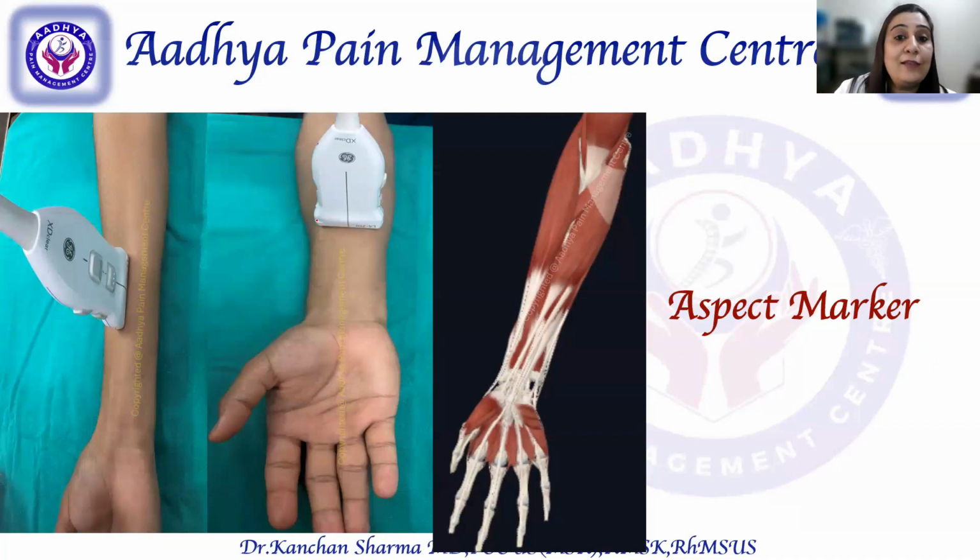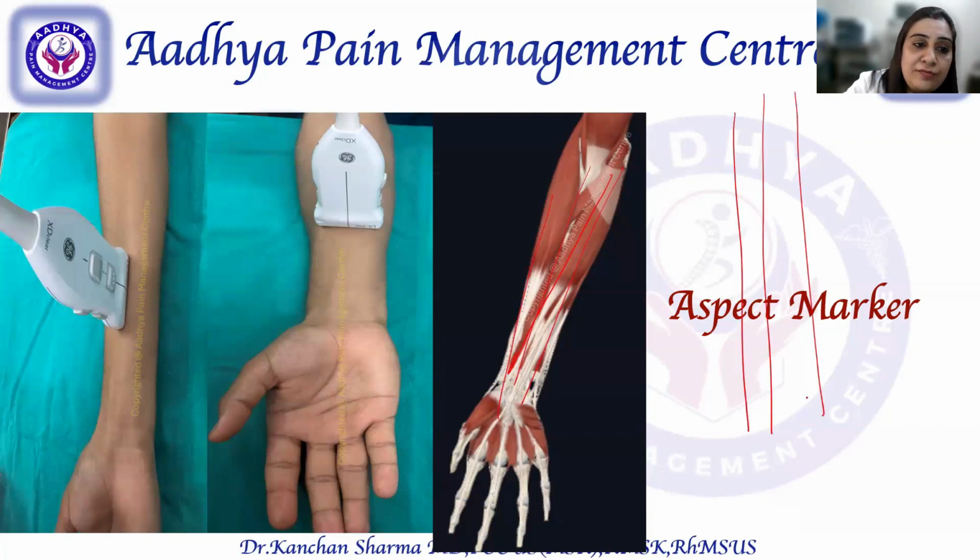So if I have to scan the forearm muscles, how are my forearm muscles? Like this, straight, like that they are going. Now if this is my aspect marker, if I have to look for the sagittal section, how am I going to keep my probe? I am going to keep the aspect marker in a craniocaudal direction. So I am looking at the longitudinal axis of the forearm muscles.